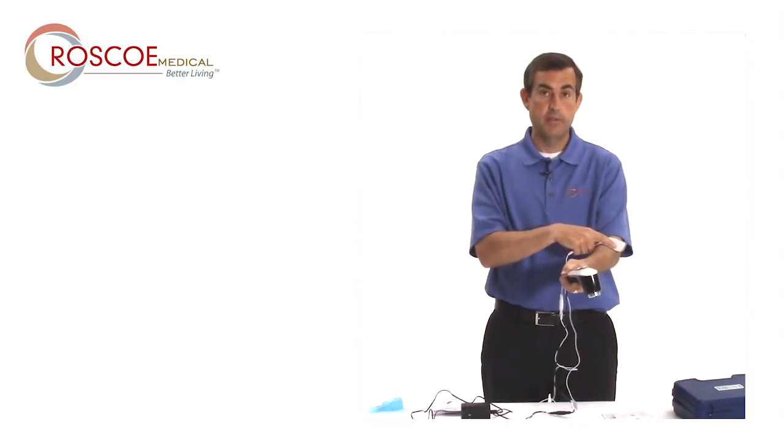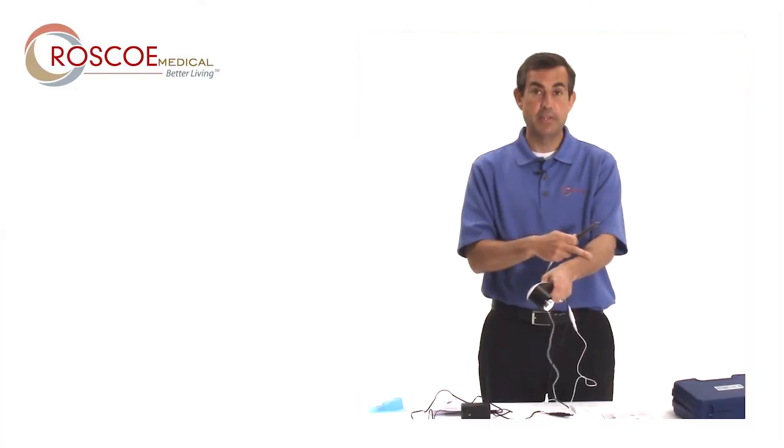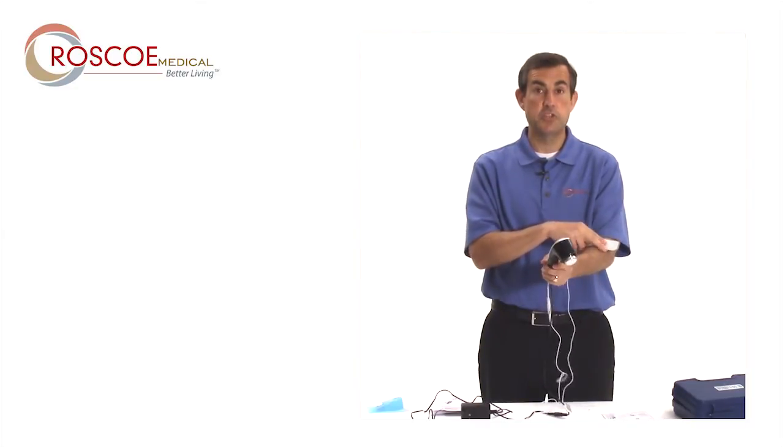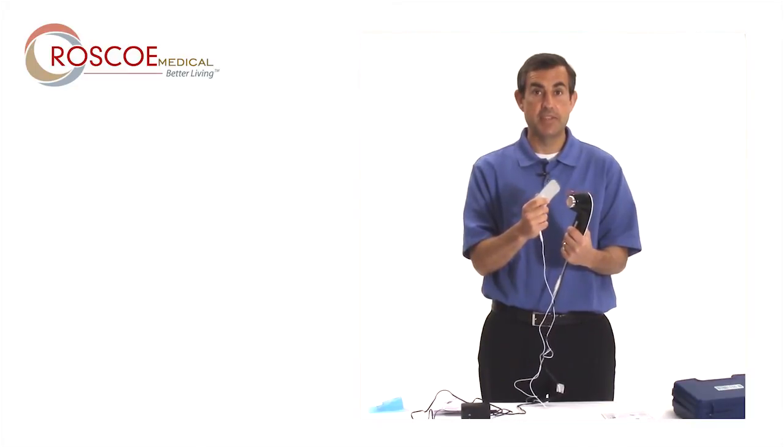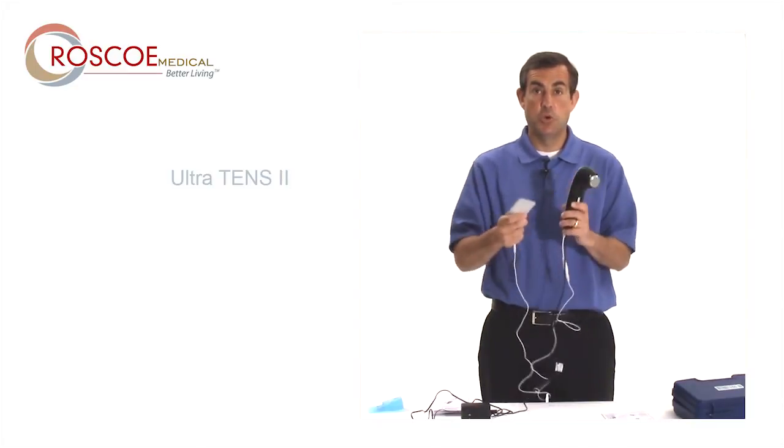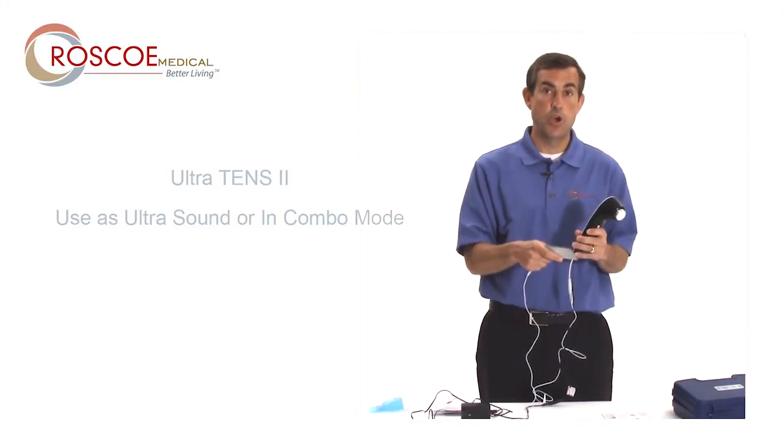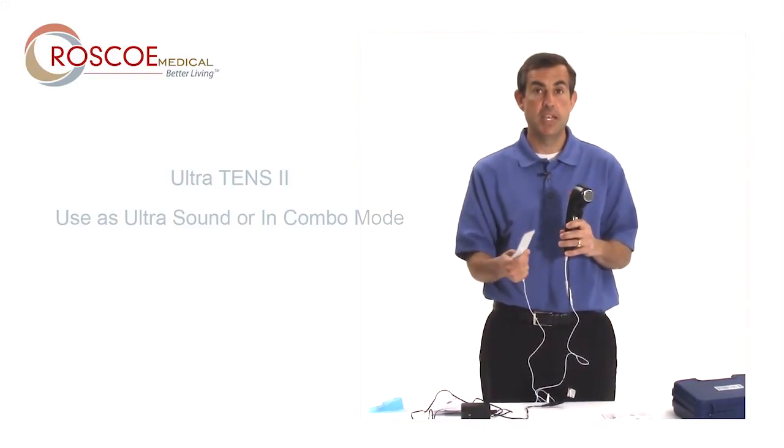So this is going to be my ground, then I'm going to put plenty of ultrasound gel on there, and you'll have the other electrical impulse coming out of the sound head of the ultrasound machine. So Ultra TENS II, I can use it as an ultrasound, or I can use it in combo mode.